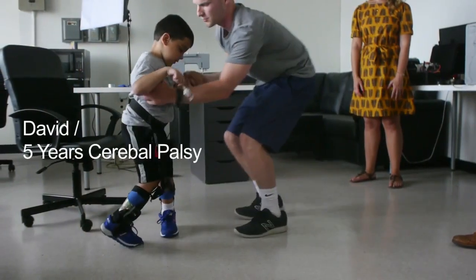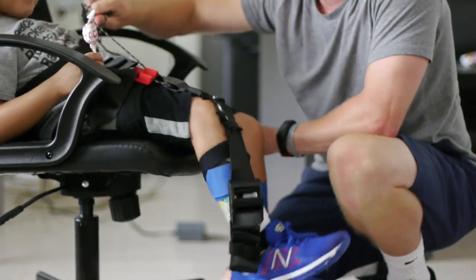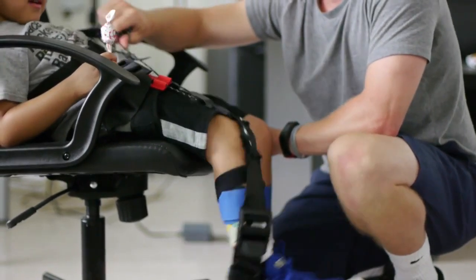Besides the adult exoskeleton, we also invented a pediatric version, which is purely textile based and mimics the quad muscle. The raw material cost is under $50.